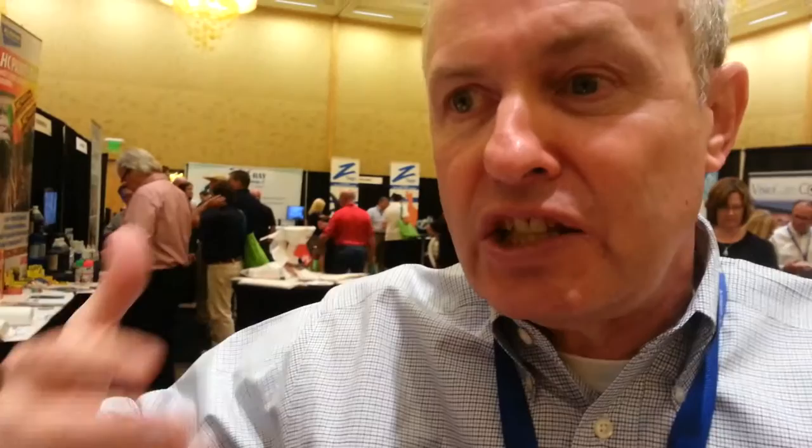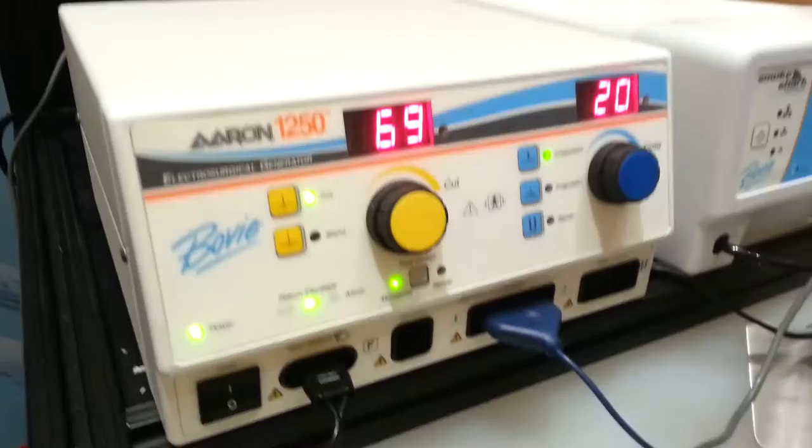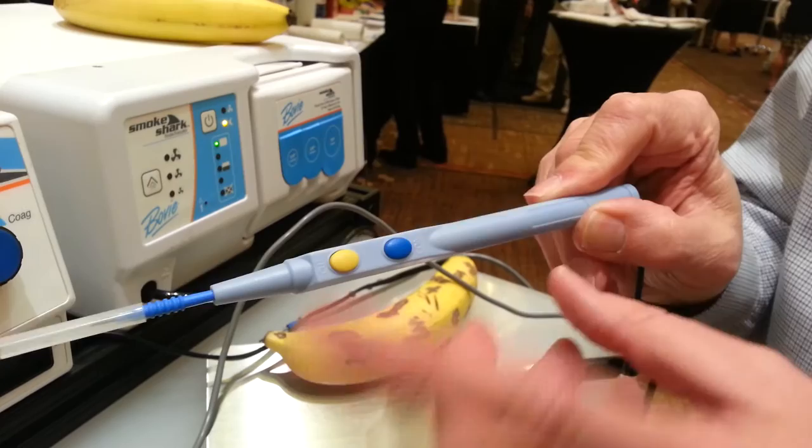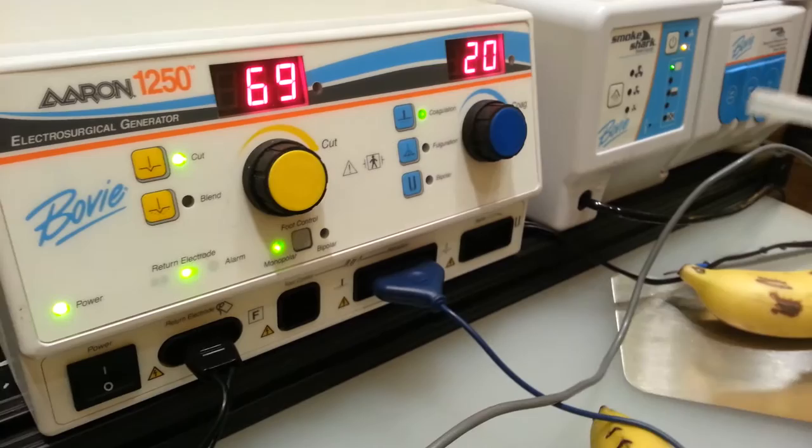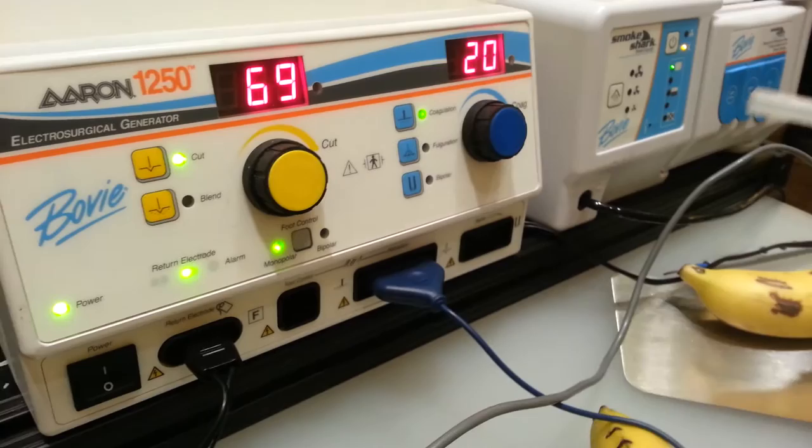If I'm in a sterile field, I have to have a technician switch it from cut to coag. Where on the 1250, my cut and my coag are right on the pencil, so I can go back and forth, and I don't need that technician to switch from cut to coag. So if I'm in a sterile field, I can basically handle all the different settings from the pencil versus doing it from the generator.